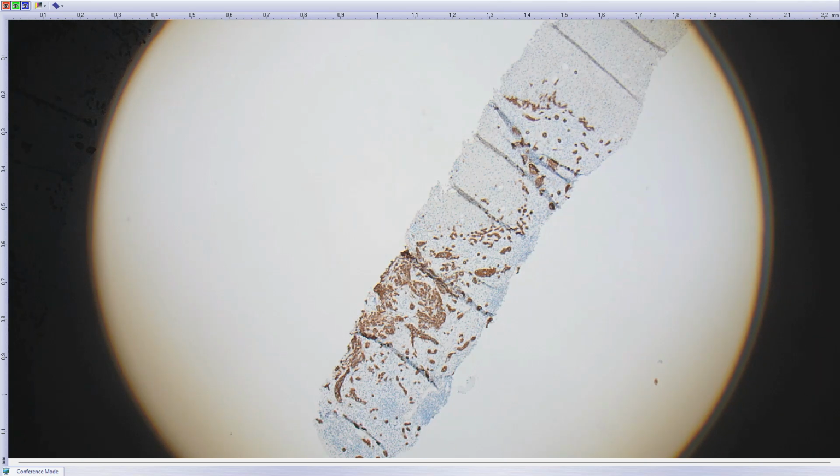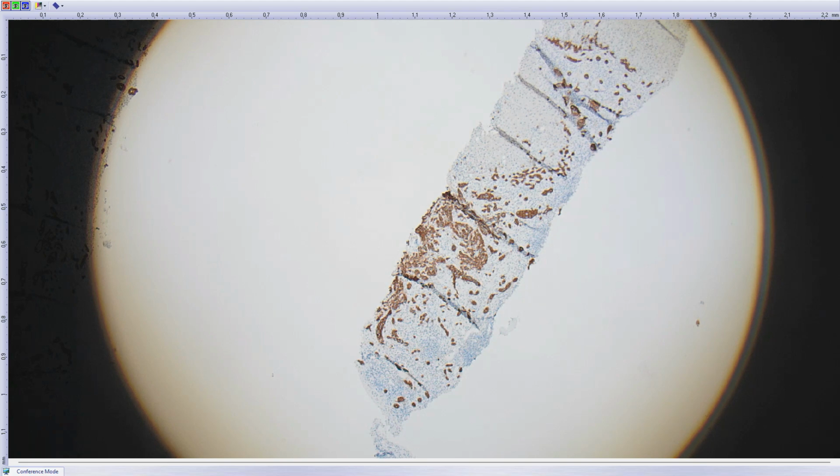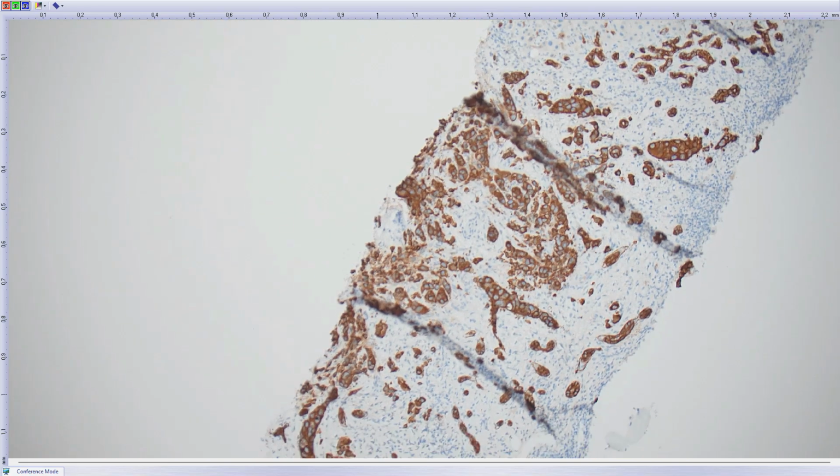As for primary cholangiocarcinoma, it does not have any specific or very characteristic immunomarkers. It's always a diagnosis of exclusion, so it will have to be correlated clinically, but this is probably primary cholangiocarcinoma spreading secondarily into the colon.